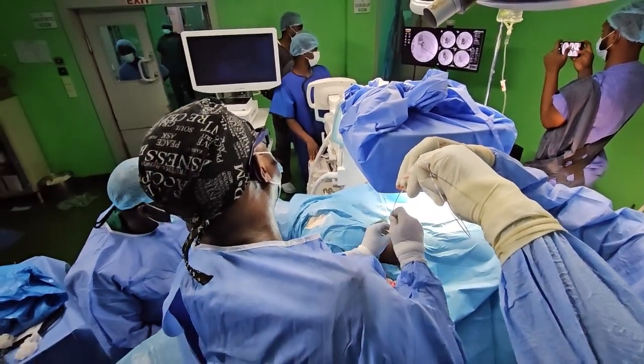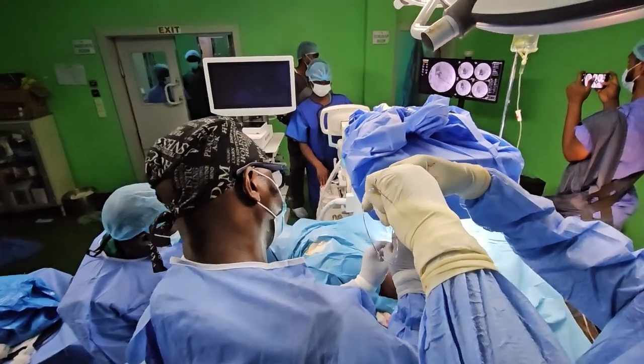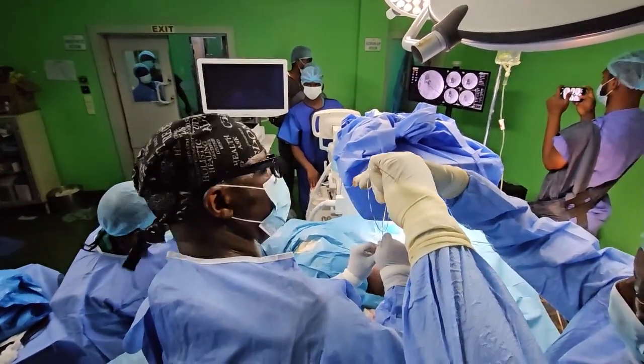Okay, now you can see the rod. That's the tip of the... So you have to advance it a little further.